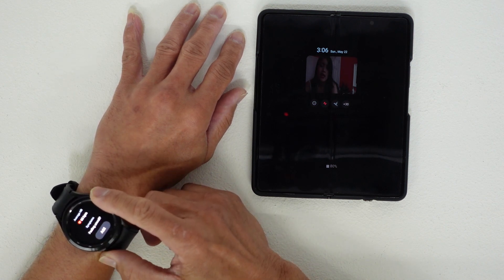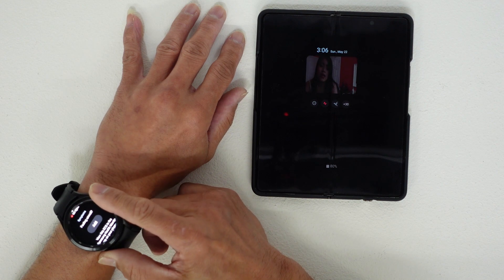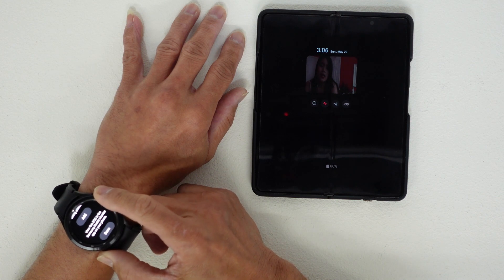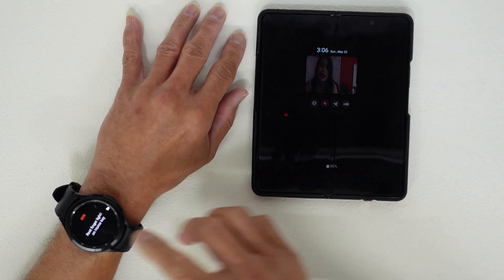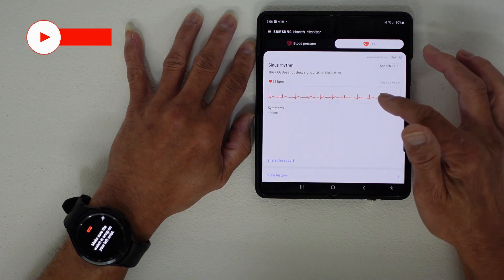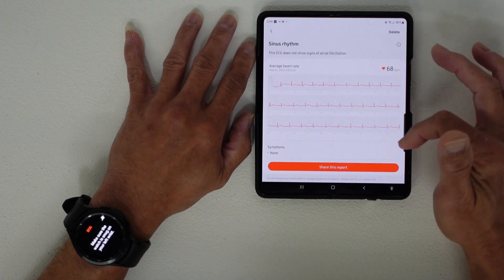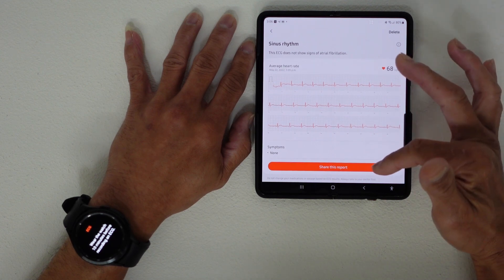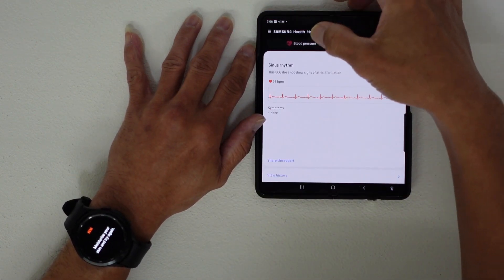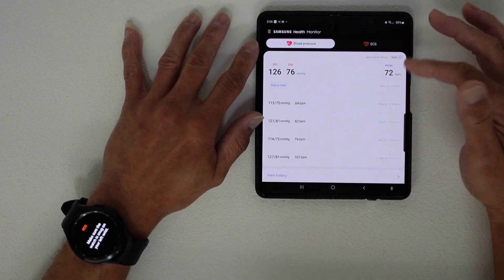After the ECG, the app asks about symptoms — you can press Add if you're feeling unwell, or view the ECG in the Samsung Health Monitor app on your phone, then press Done. In the app you can see the ECG results, share reports, and view the full history of your ECG readings and blood pressure history.